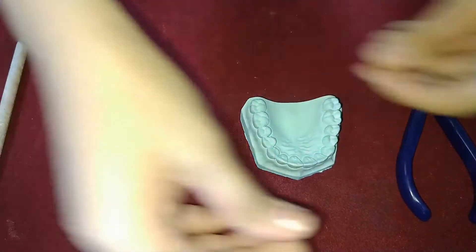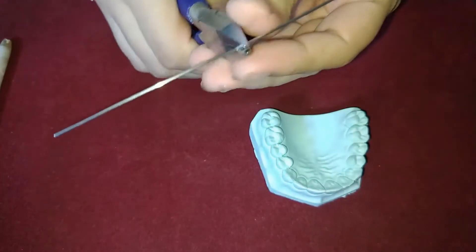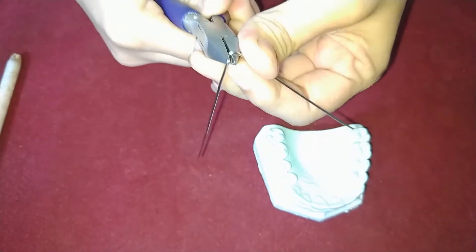Firstly, straighten the 19 gauge wire and take 10 cm of it. With the help of Adam's plier, give a sharp bend in the midline of this wire.